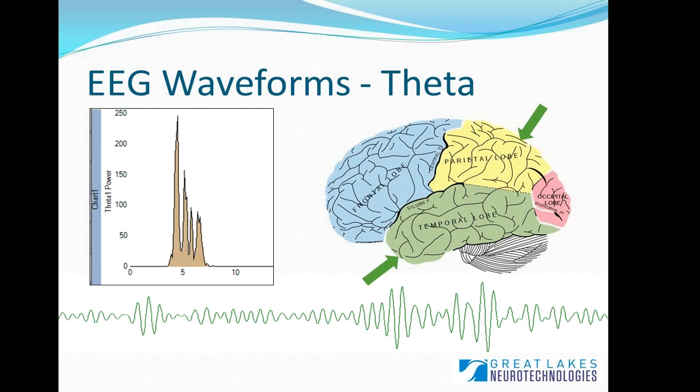In addition to just sleep, theta waves can correlate to periods of emotional stress. If somebody is frustrated or upset, theta waves can become apparent. In addition, it can be used to detect different types of degenerative brain disorders. So if something like Parkinson's disease or maybe Huntington's disease is occurring, it's commonly found that there is an occurrence and an abnormality in the theta wave.